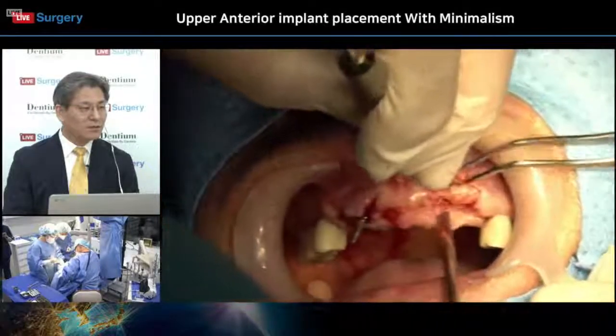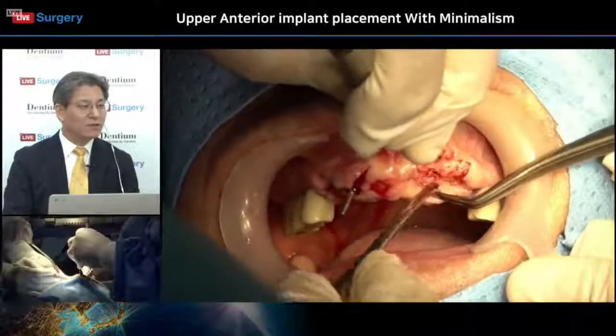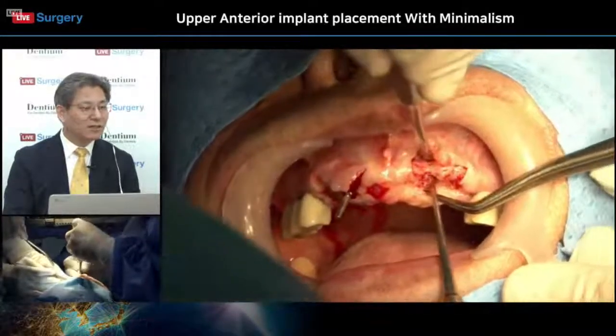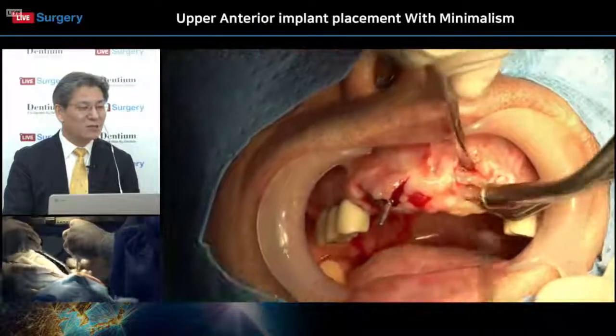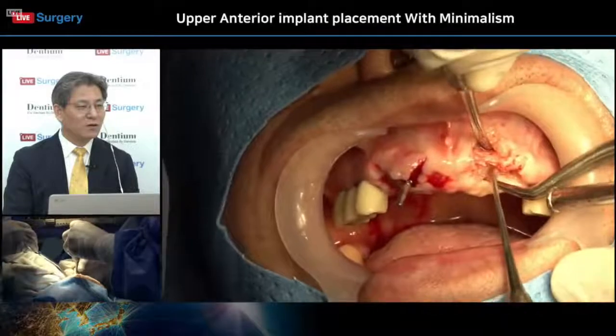Okay, so yes, bone condition is relatively very good. Bone conditions are very nice, and the socket is already healed. Actually, it looks like a partially healed site here. Remove granulation using the small round tool.